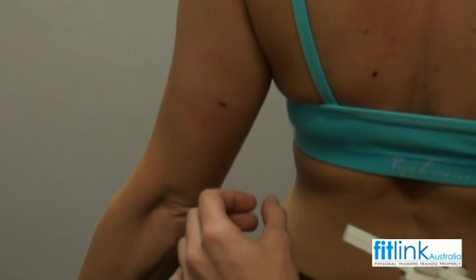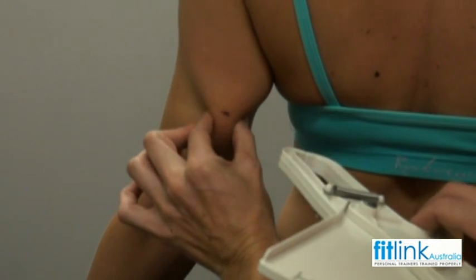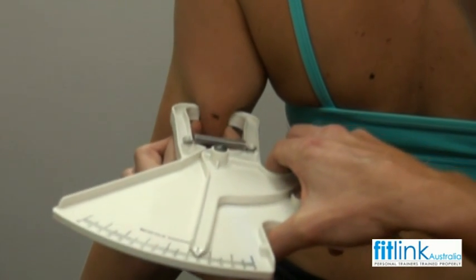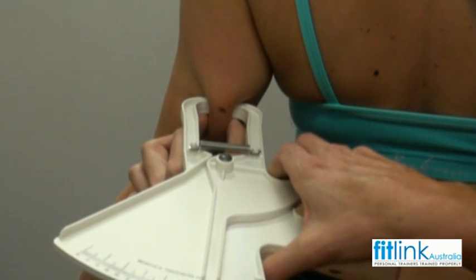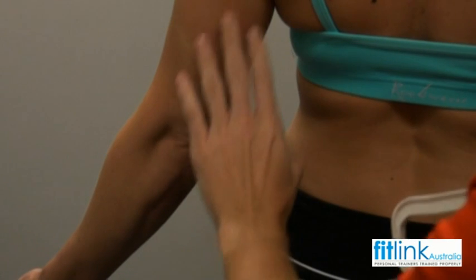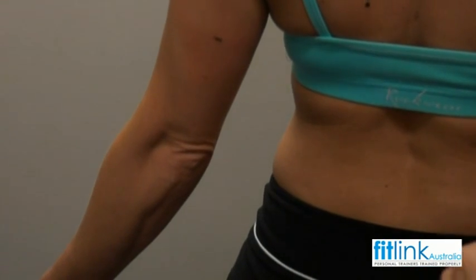Now I'm just going to do your tricep, following the same procedure as the bicep — coming around, grabbing hold of your skin, making sure that mark's in the middle, place my calipers on, and find my reading. We've got 16 there. Just let that relax for a couple seconds, and then I'll take a further two readings from that spot.